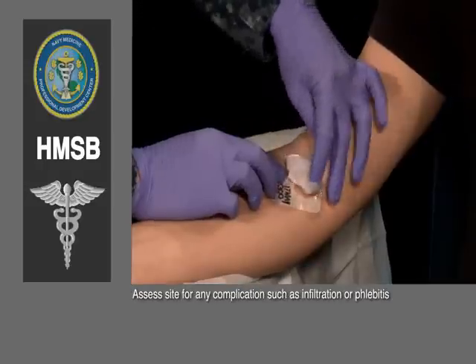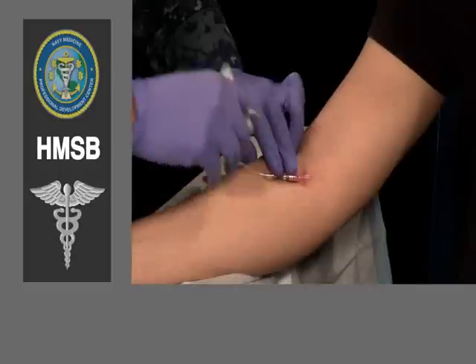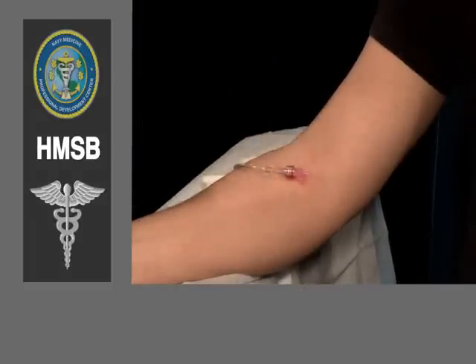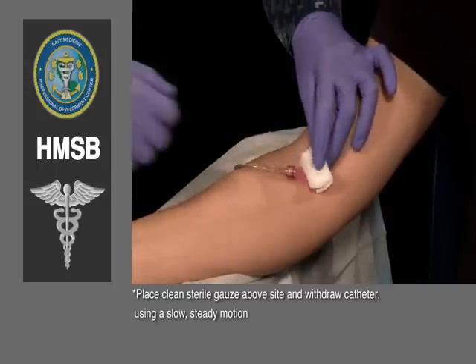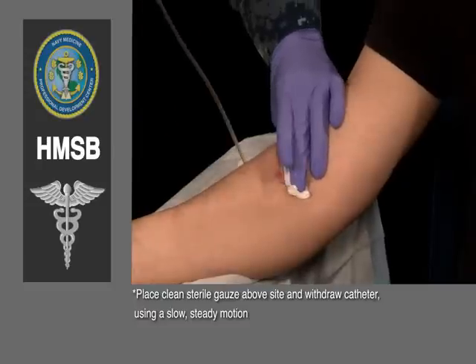I'm also going to assess the site for any complications such as infiltration or phlebitis. I'm then going to place my 2x2 gauze over the site while slowly withdrawing the catheter.